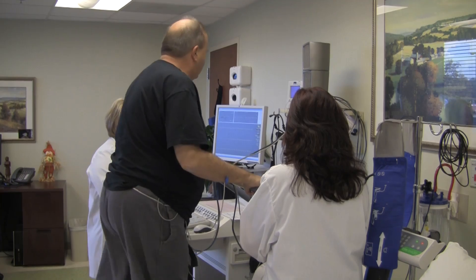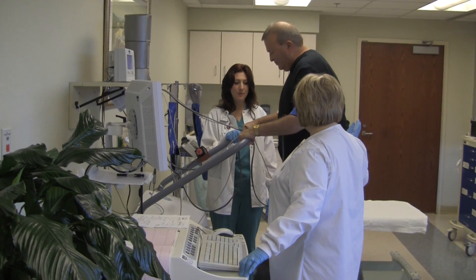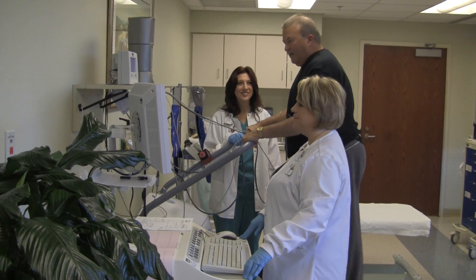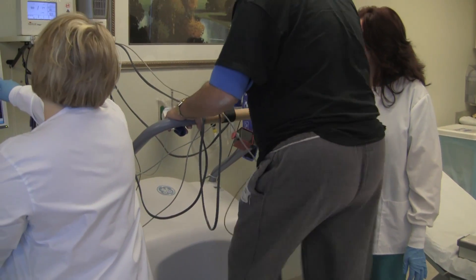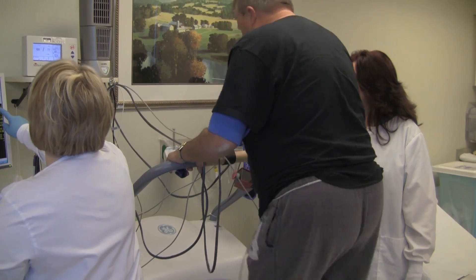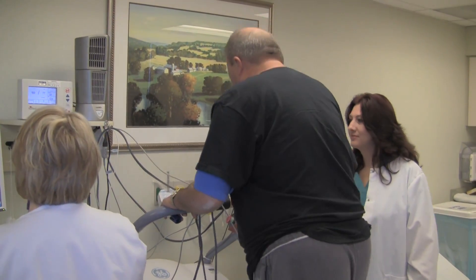We have 30 seconds, so it will get a little faster and the elevation will get a little higher. Good job. Now you're getting closer — you're at 76 or 77% towards your maximum. Current heart rate is 122. You're four minutes into it.